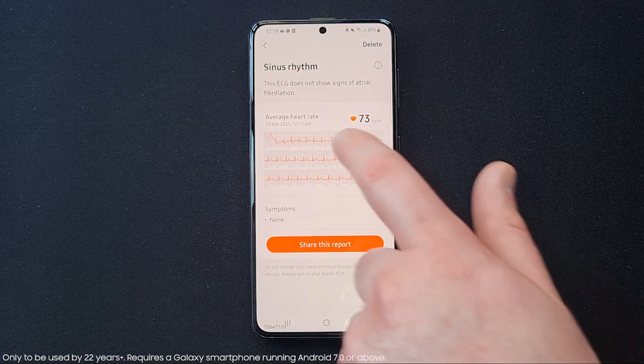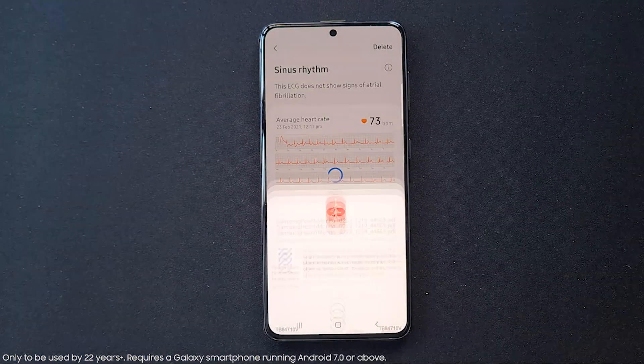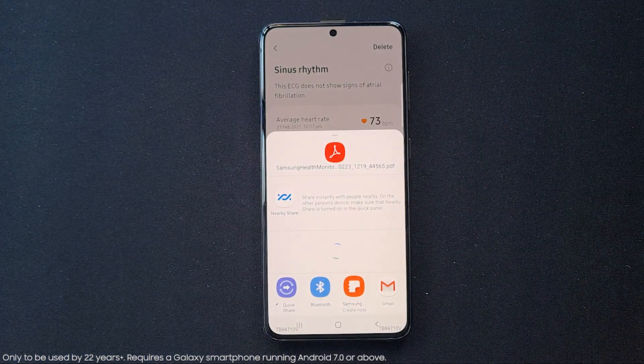This recording will provide insight into your health to help make more informed decisions and live a healthier life. This feature is now available on our Galaxy Watch 3 and Galaxy Watch Active 2, all through our Samsung Health Monitor app.